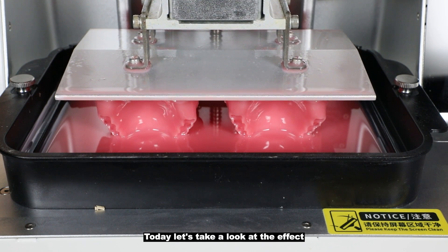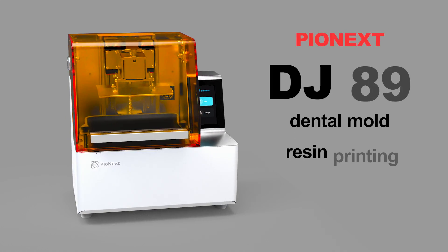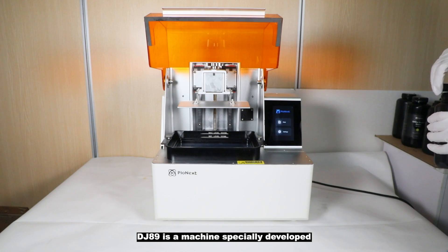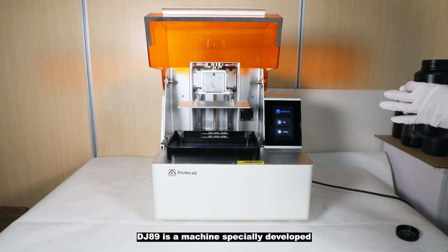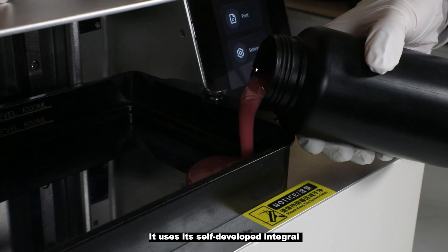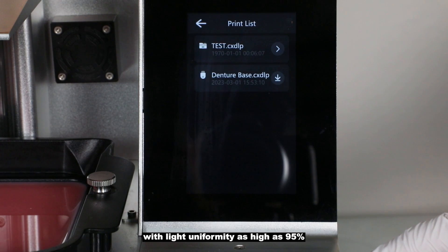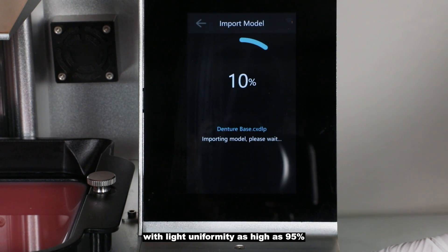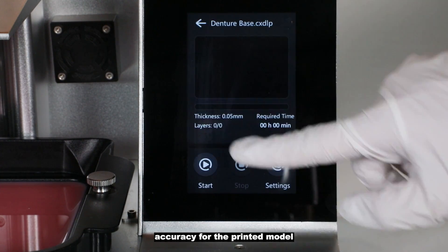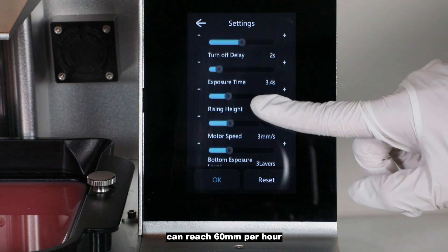Today let's take a look at the effect of using the DJ 89 to print a denture base. DJ 89 is a machine specially developed and manufactured for the dental field. It uses its self-developed integral LCD light source with light uniformity as high as 95%, providing very high quality printing accuracy for the printed model. The printing speed of DJ 89 can reach 60 millimeters per hour.